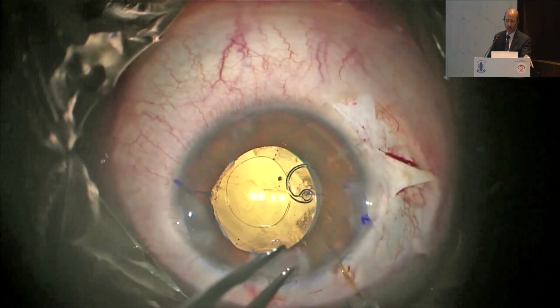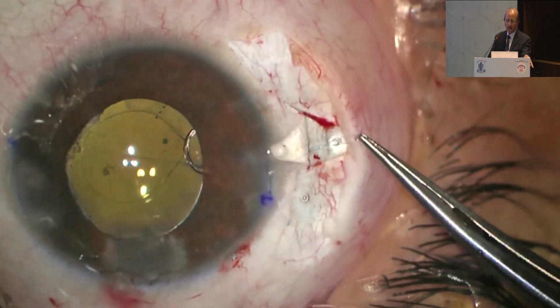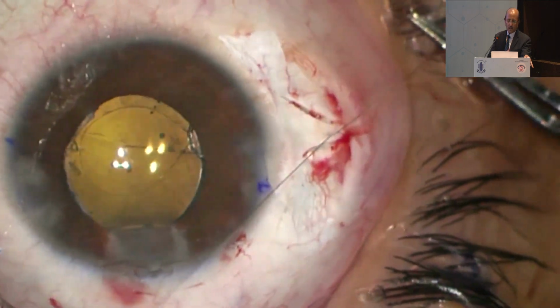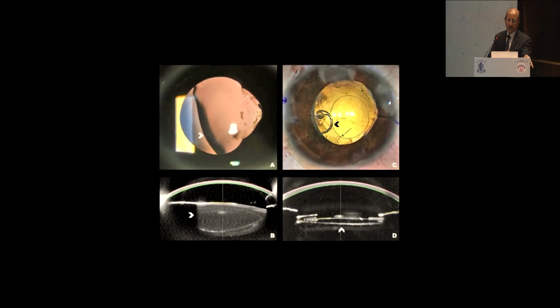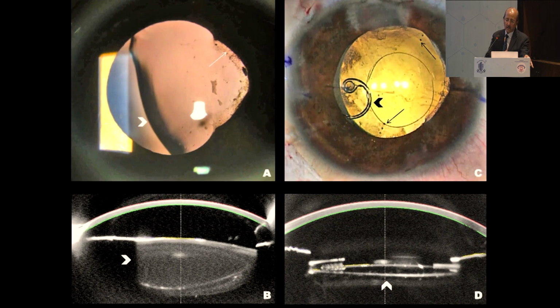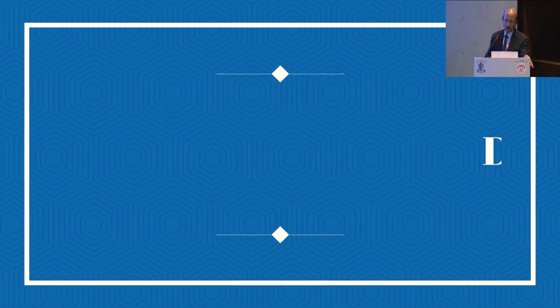and the final position of the IOL, and this is after removal of the hooks. This is before and after surgery. This is anterior segment OCT also.